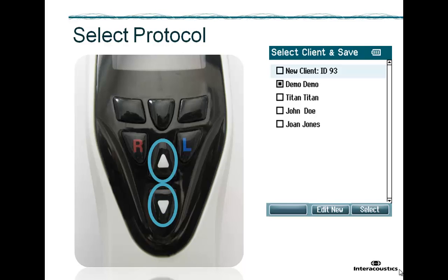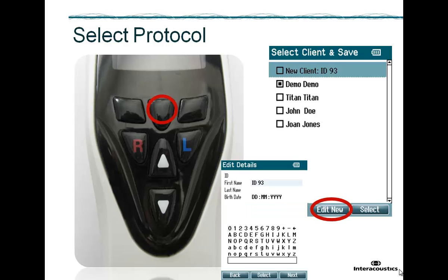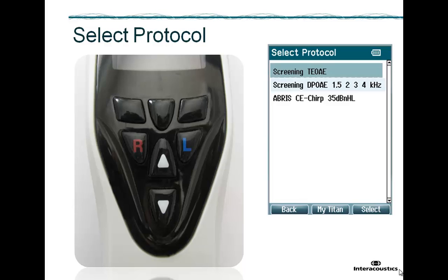Turn Titan back on by using the R or the L button, then use the up and down keys to find your client in the list and press select to proceed. In case your client is not in the list, you can choose New Client. Optionally, you can edit the details of the new client before selecting it. The next step is the selection of the TE-OAE, DP-OAE, or ABRIS protocol. Move the up and down keys until the needed protocol is highlighted and press select to proceed.